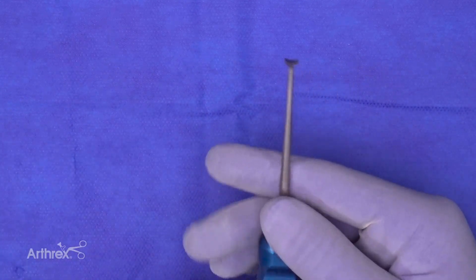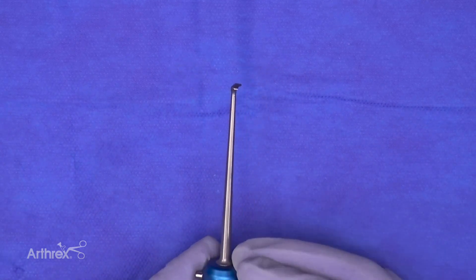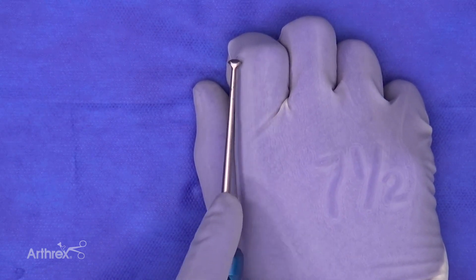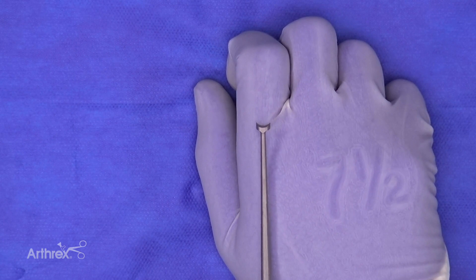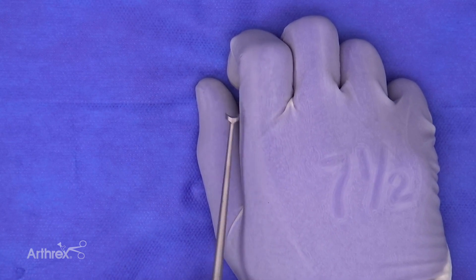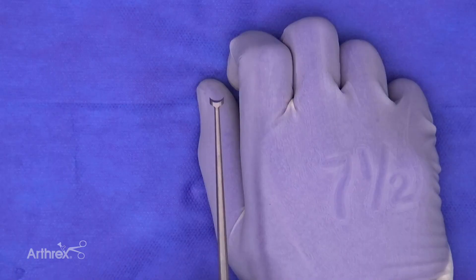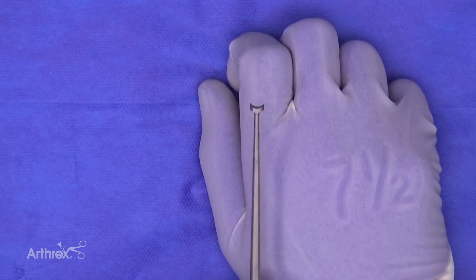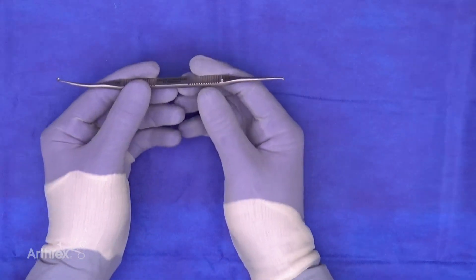One side of the instrument is curved downwards and the other side is curved upwards. The down-curved side works in the posterior aspect of a cartilage defect — the surgeon rakes and pulls to make a nice rim. On the anterior portion of the lesion, they use the reversed curve — cutting into the cartilage and pushing away. This allows surgeons to create a nice rounded curved defect so they can insert biocartilage or any other biologic material to fill it.